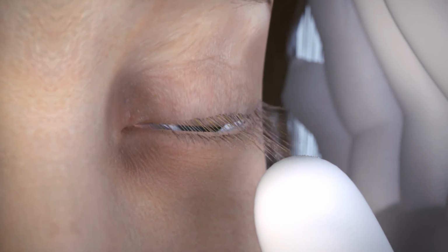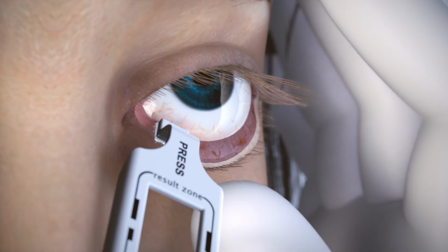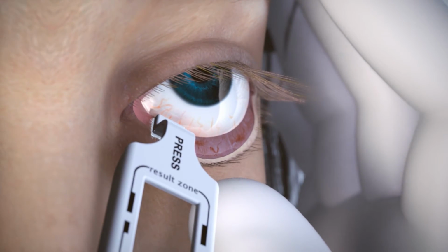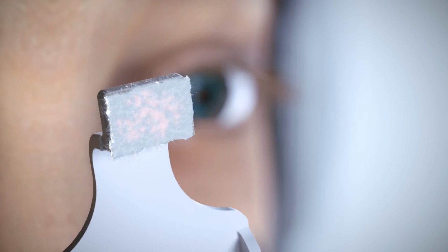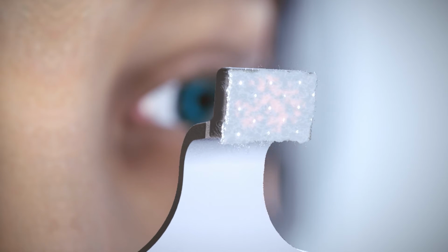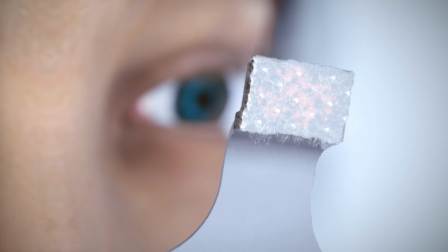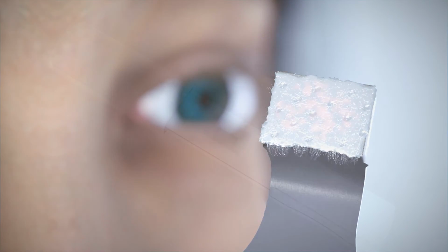After completing a minimum of 6 to 8 dabs along the conjunctiva, allow the sampling fleece to rest on the conjunctiva an additional 5 seconds to ensure saturation. Visually inspect the sampling fleece. When a sufficient tear sample is collected, the fleece will glisten. The fleece may also turn patchy pink in color, depending on the patient's tear composition. If the fleece is not glistening, repeat the tear sample collection process.